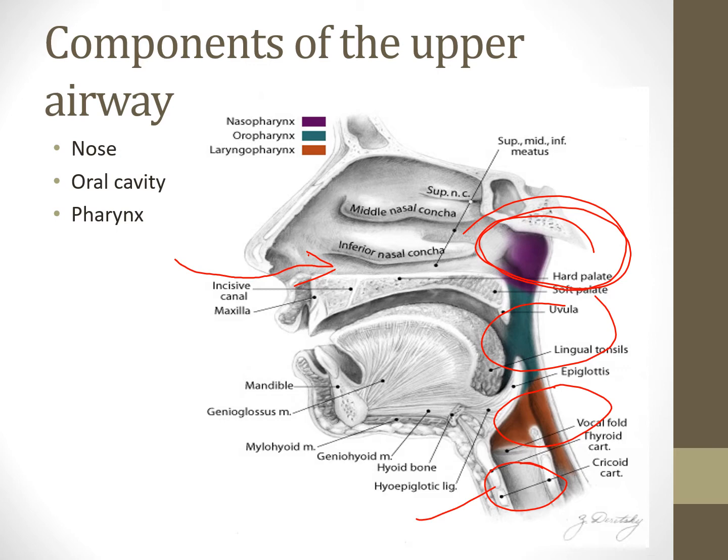And when we put that nasal trumpet in, make sure it's lubricated. I always put a little bit of saline in there before I put the lubricated nasal trumpet in, just to help moisten and loosen everything up, so that it wouldn't tear at any tissue as I was inserting the nasal trumpet. So different things like that.